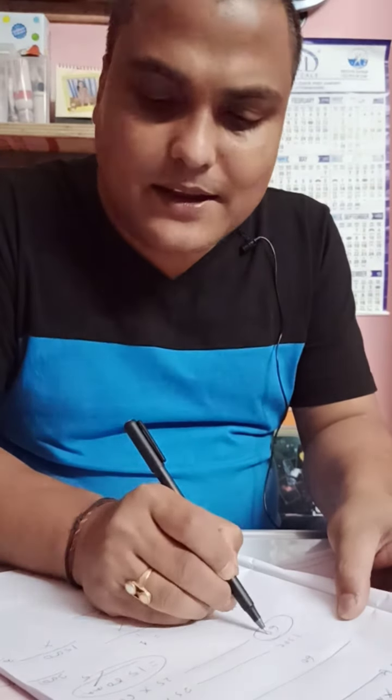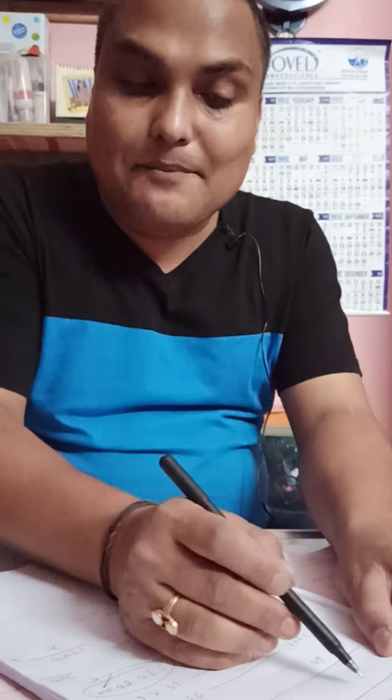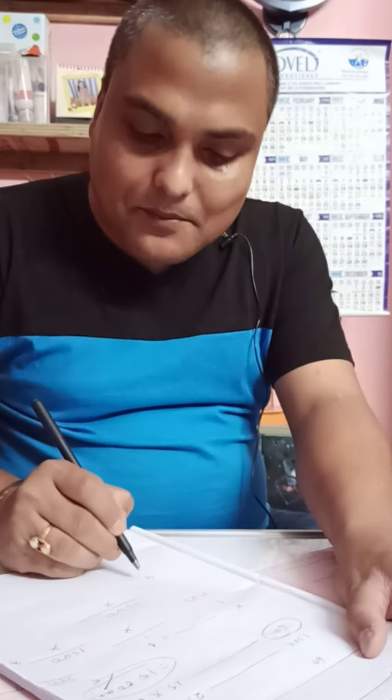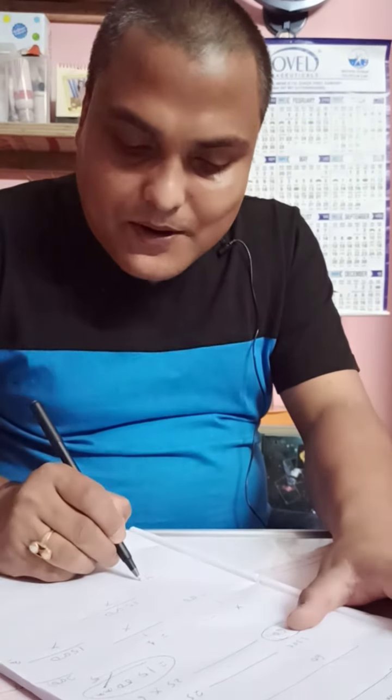In 60 seconds, the paper will move 300 big squares, each of dimension 5 millimeter by 5 millimeter. Suppose there are y number of big squares between two R waves. At a y big square interval, one heart contraction comes.